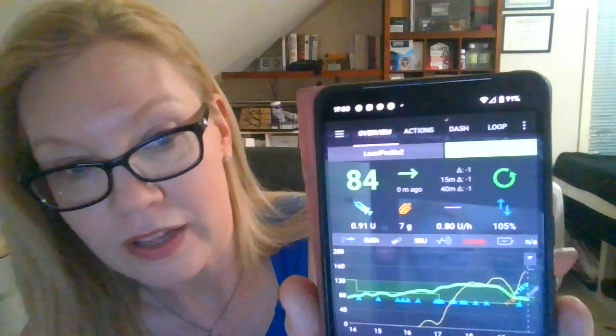And that's it. My pod is inserted and it's going — 0.8 units an hour. Hope that helps.